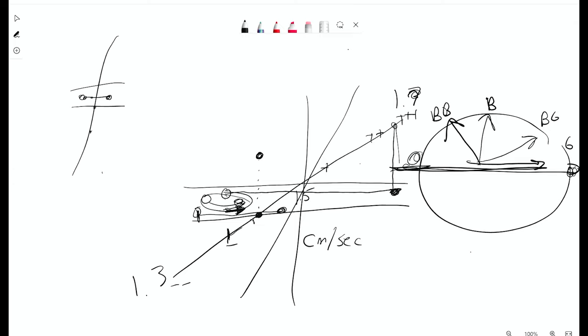Right. And I might be encroaching on CSF flow studies a little bit, but when we are quantifying, you want to make sure you're going through plane, right? The only way we can really quantify is with through plane flow. And so what's the purpose of in plane? In-plane flow is typically for visualization of whether something is open or closed. Typically in a CSF flow study, you're primarily concerned about a Chiari getting in the way of CSF moving through the brain, or the aqueduct of Sylvius. Make sure that's open and patent.